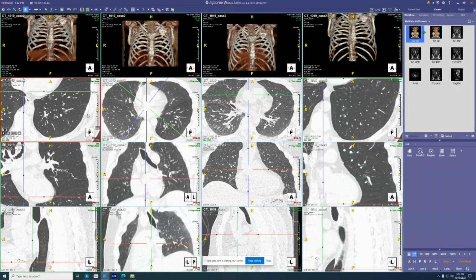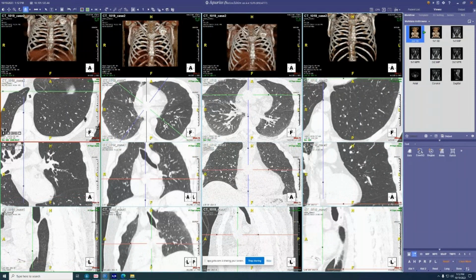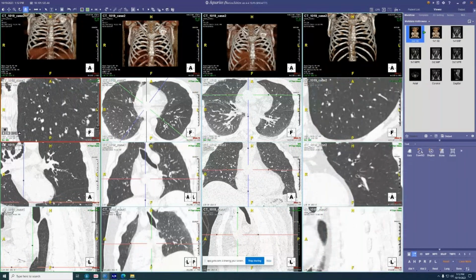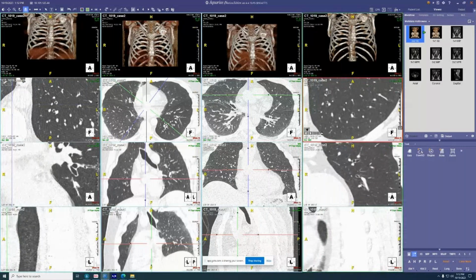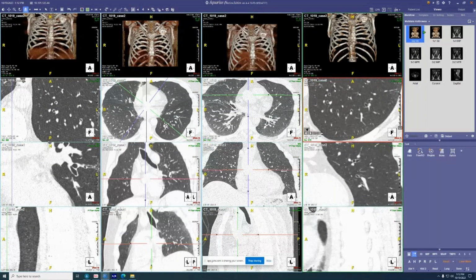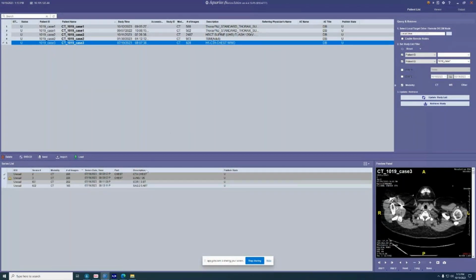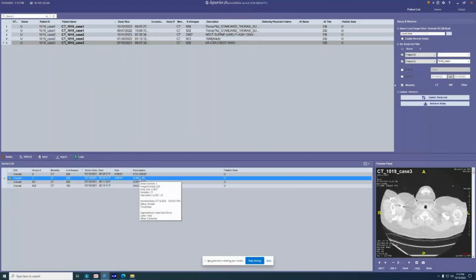I don't know exactly what, but you can see the large airways themselves are much less thick. Look here, the large airways themselves, they're still thick, but they're not as thick. So there is some diffuse improvement, at least on imaging, of that airways disease. But I agree, it's usually not this impressive. At least I've never seen a case like that. And it's a cute case.